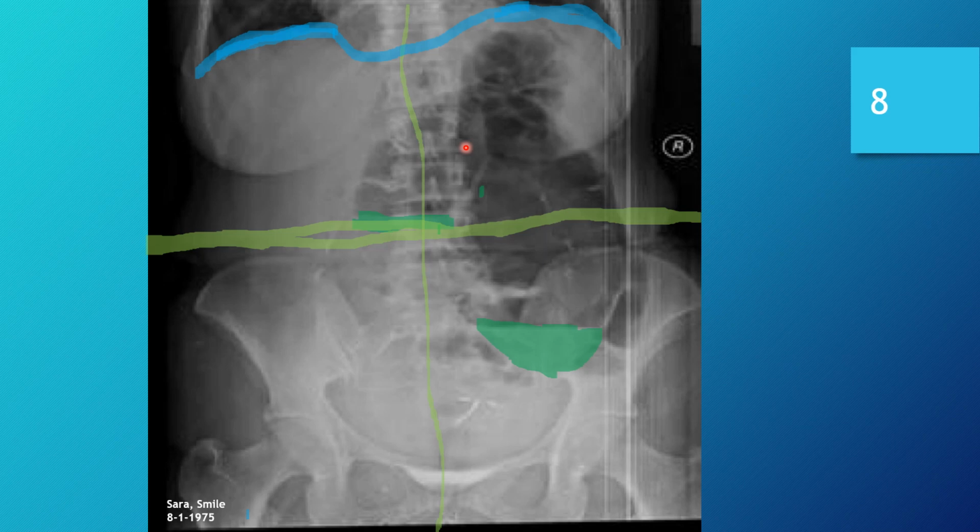So moving on to whether or not it is properly positioned. As you can see, my reference line here, it's not a real great shade of yellow for this image, but right through here was the inferior superior central ray reference line, and it looks like it's basically right on top of the iliac crest. So they were a bit low. I think they actually probably got lucky in this case that they were able to get the entirety of the diaphragm on that presumed right side.